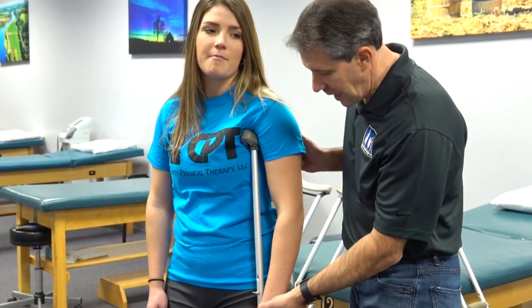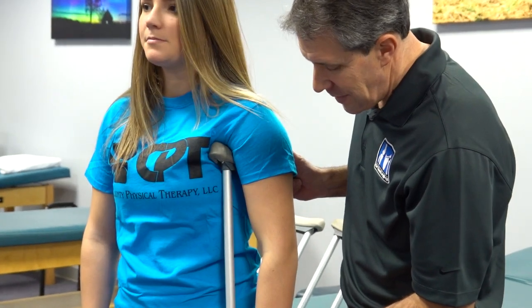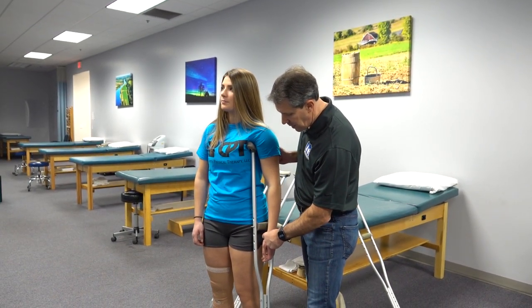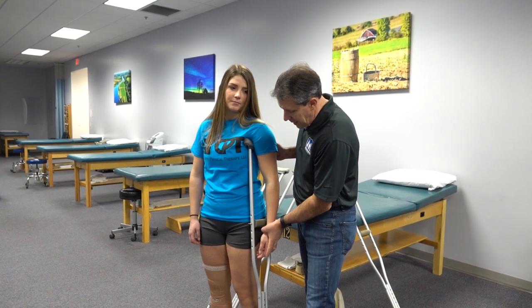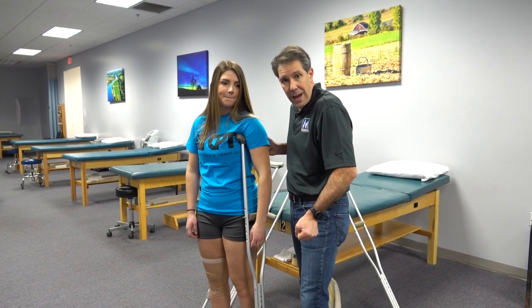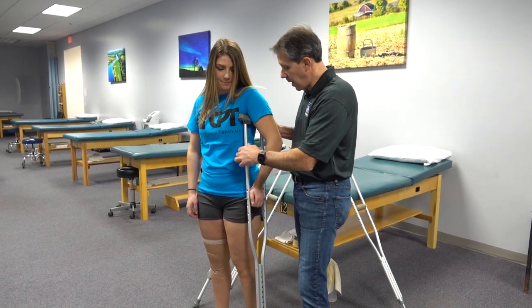If you take a look at this handle, you'll notice that this handle is too high. The handle should be sitting at the wrist, and that will allow her to have her arm in a slightly bent position to be able to put pressure through the hand so that it's not all coming through the armpit.